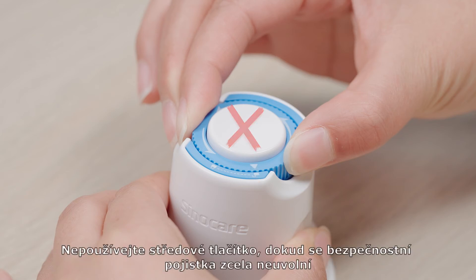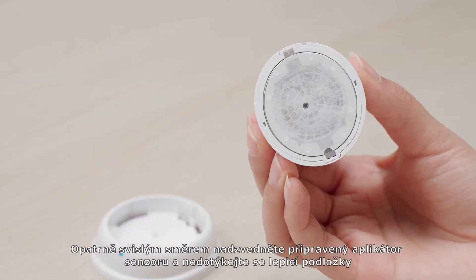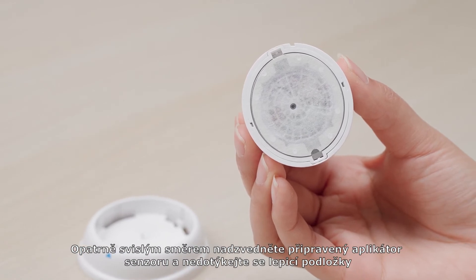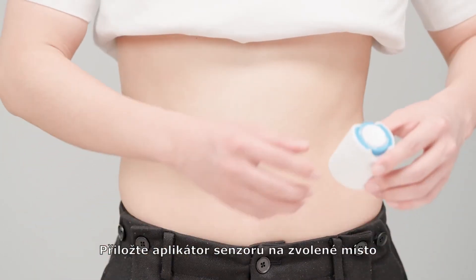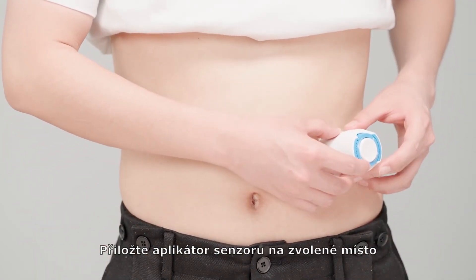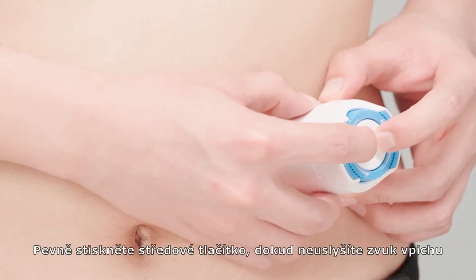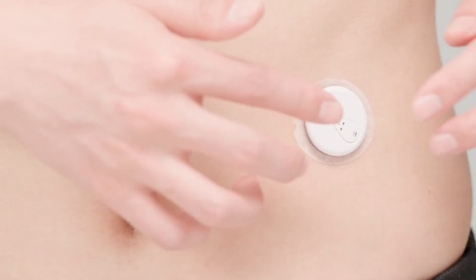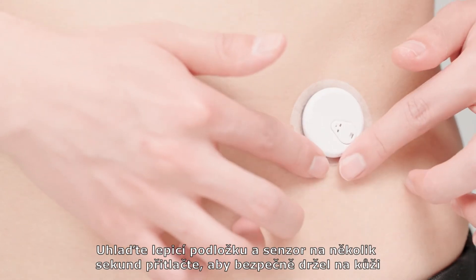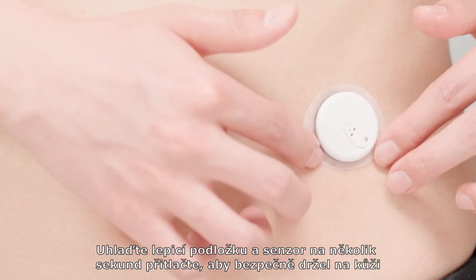Do not push down the middle button once the safety switch is fully released. Gently and vertically lift the armed sensor applicator and don't touch the adhesive patch. Fully place the armed sensor applicator over the chosen site. Firmly press the middle button until you hear an ejection sound. Gently remove the applicator from the injection site. Smooth down the patch and press on the sensor for several seconds so that they stick securely to your skin.